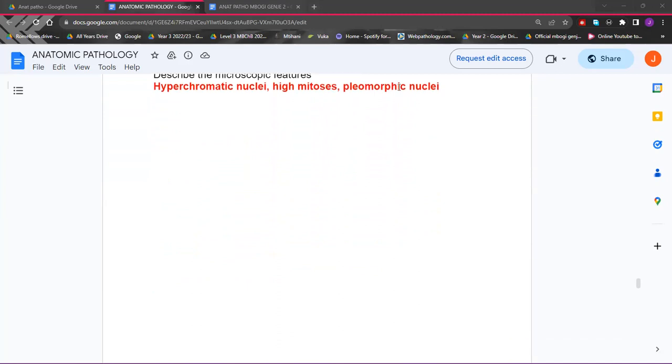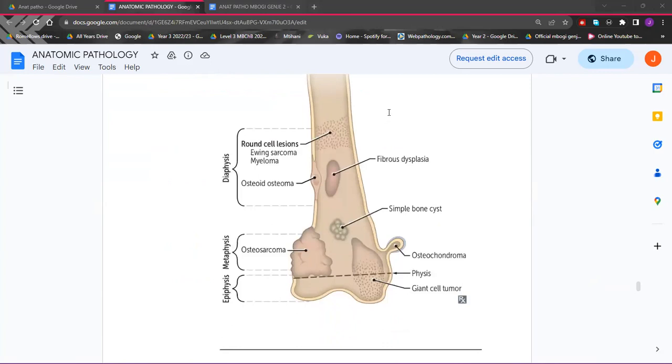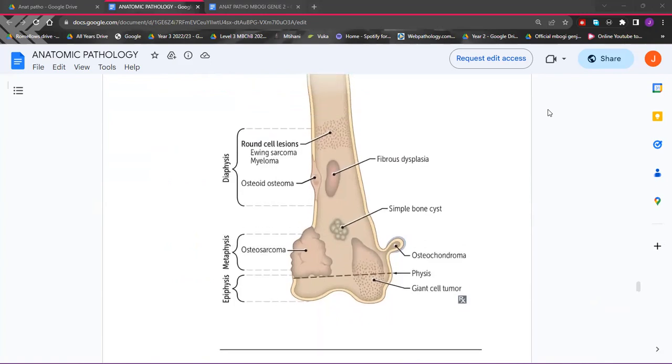So this is basically showing the various bone tumors and where they appear and how they look. You can see there the osteosarcoma presenting with some lifting of the periosteum. Also, it's a large, bulky tumor mass. Maybe you can get some time and look at that. The giant cell tumor, you can see there the soap bubble sort of appearance. Okay, we move to the next pathology.